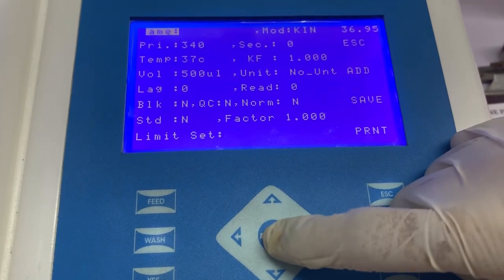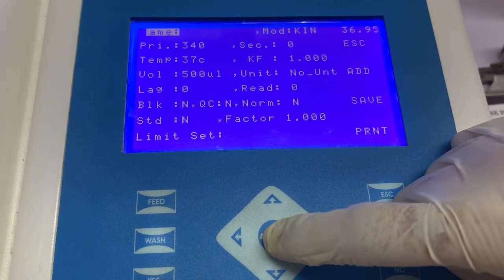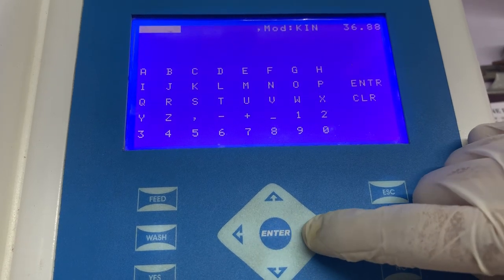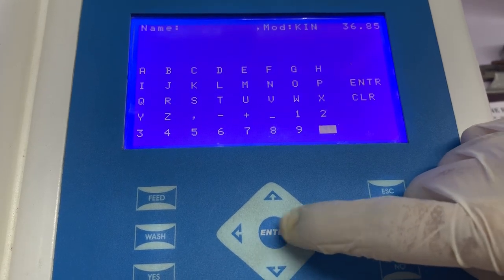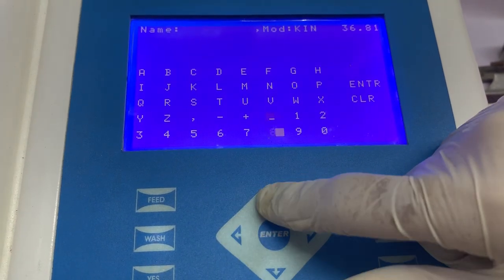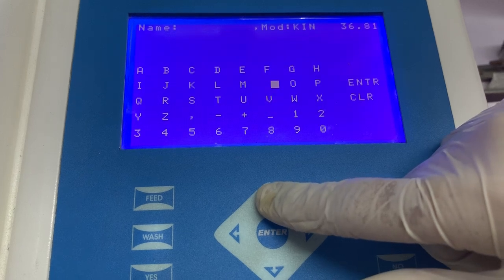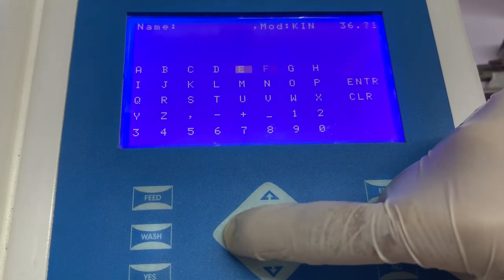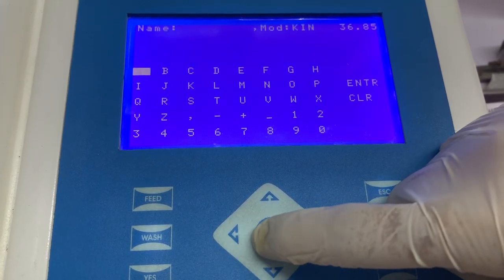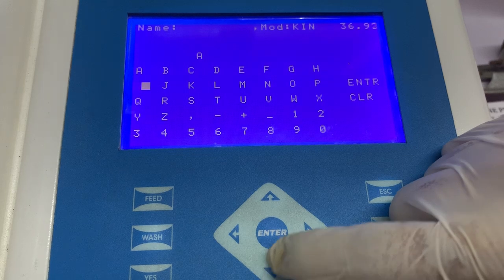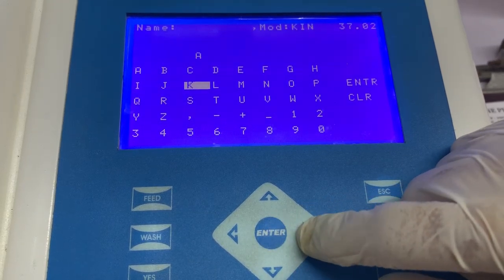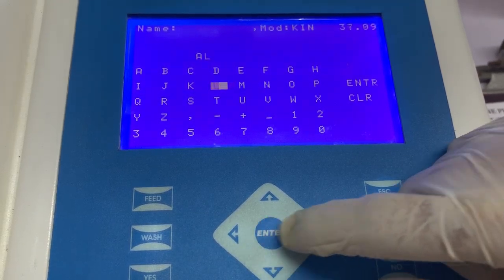As you can see, you have to enter multiple information here. The first information that needs to be entered is the name of the test. You can enter any name which is suitable according to your laboratory settings. In this video we are entering ALP as the name of the test.